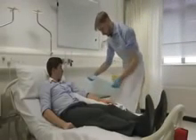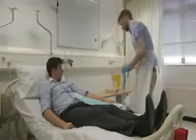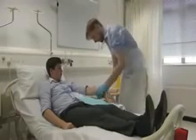Gain informed consent for the procedure. Next, prepare your patient by selecting an appropriate arm and placing it on an absorbent sheet. Next, tie your tourniquet approximately 3 to 5 inches above where you plan to insert your cannula. The tourniquet should be tied so that it is easily releasable, like so.